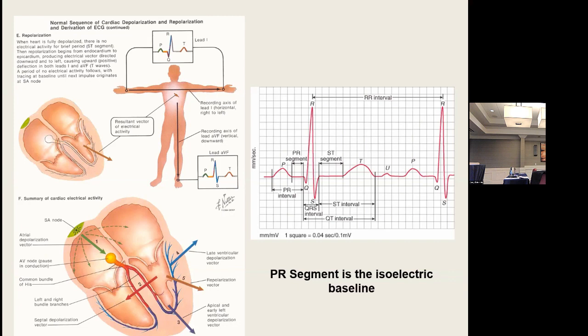We also characterize morphology of ST segments. Is it upsloping? Is it downsloping? Concave? I'm going to talk about that in a minute, but I just wanted to introduce this concept. This is for measuring, okay? And talk about sensitivity and specificity with regard to EKGs.